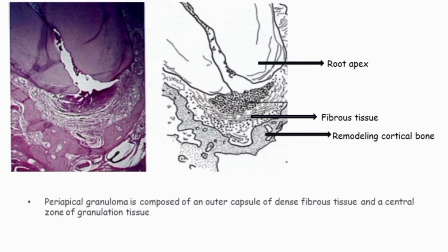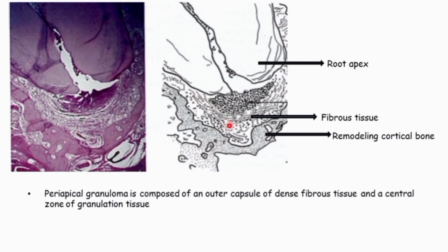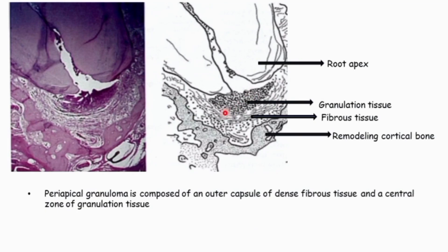Periapical granuloma is composed of an outer capsular fibrous tissue. This is the outer capsule of dense fibrous tissue, and a central zone of granulation tissue. This is the central zone of granulation tissue.